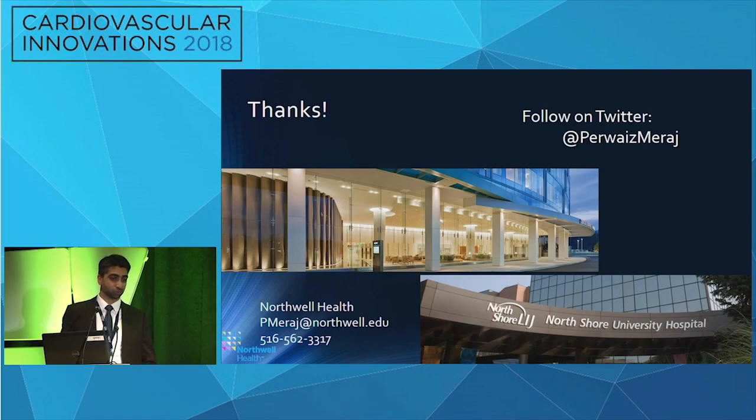in those patients in whom stents are placed, where there's a lot of calcium behind those stents, where you didn't debulk up front and you didn't do what you should have done up front, and you now need to expand those stents. I think we've all used 40 atmosphere non-compliant balloons, hoping the balloon wouldn't burst, and tried using chocolate balloons and other balloons.